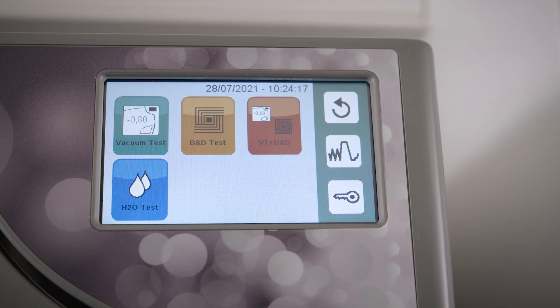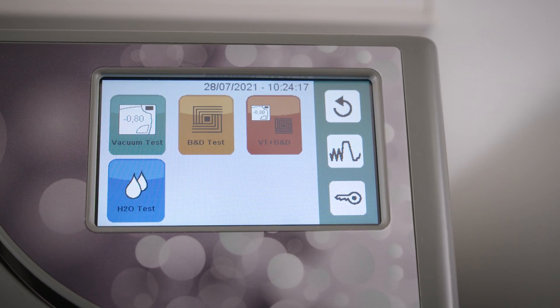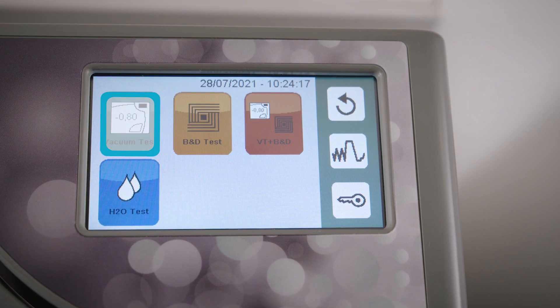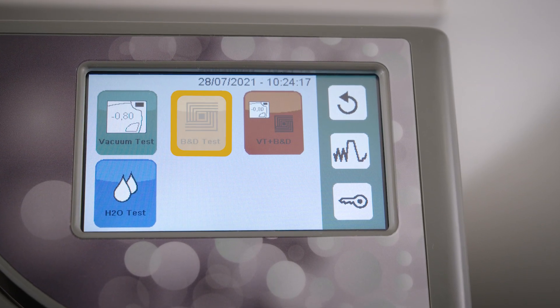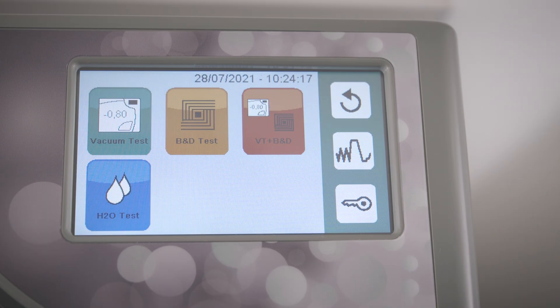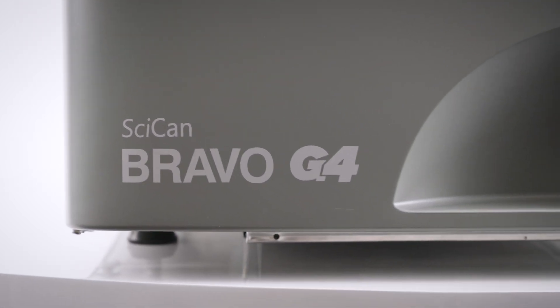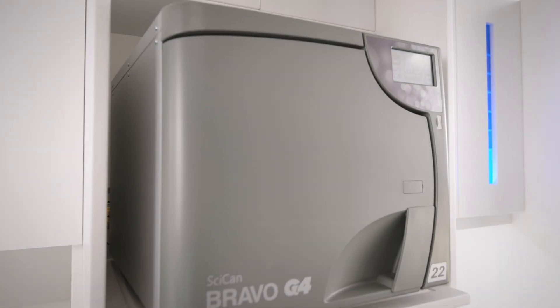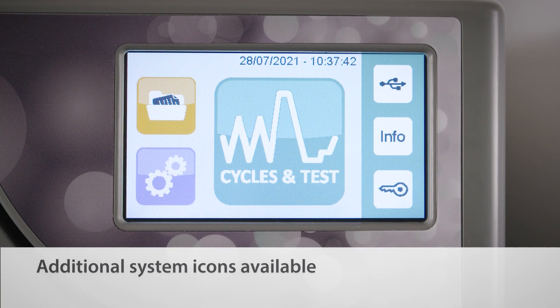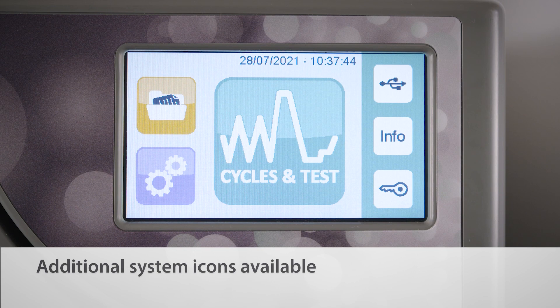The Bravo G4 offers three test cycles to periodically check the unit's effectiveness: a vacuum test, a Bowie-Dick test, and a cycle that allows the vacuum and Bowie-Dick test to be run back-to-back. Follow the instructions in the operator's manual for properly performing these tests. Please follow local guidelines for the required frequency for performing all sterilization monitoring tests.